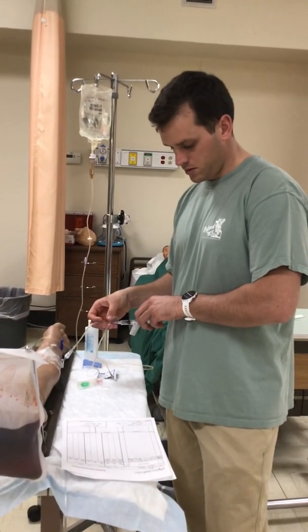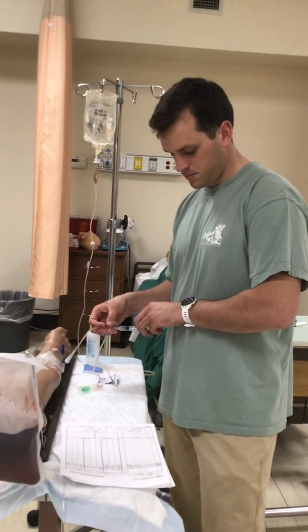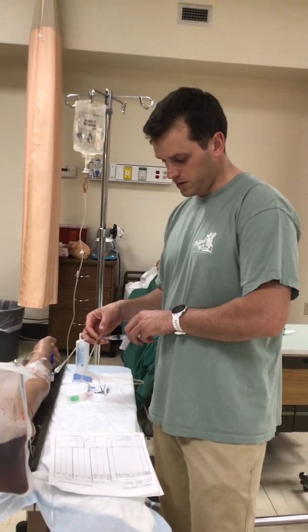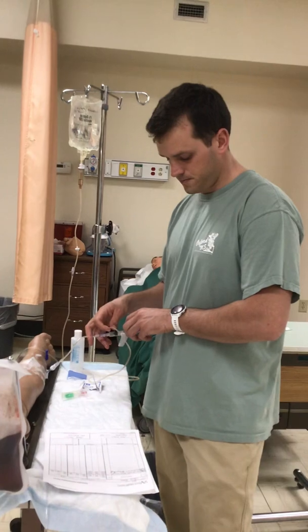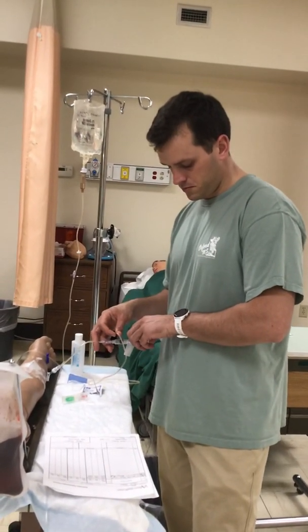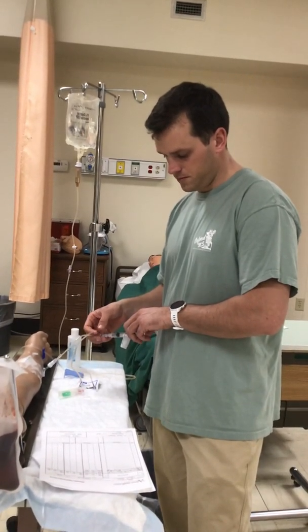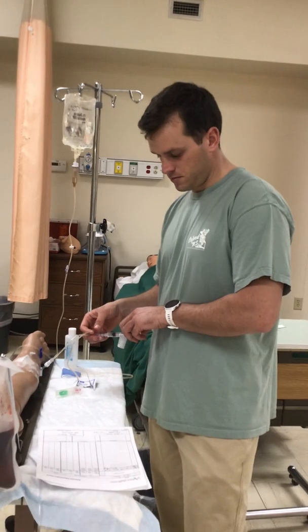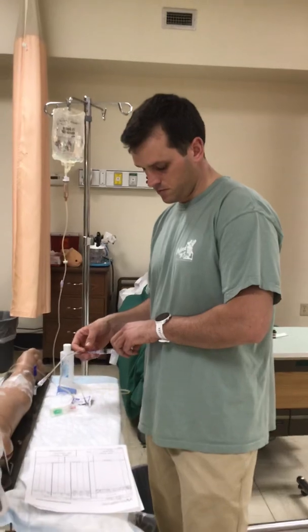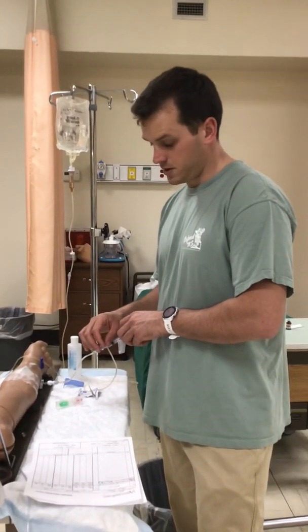Pinch, administer, release, flush it. Pinch, administer, release, let it flush. This time it's been a minute.